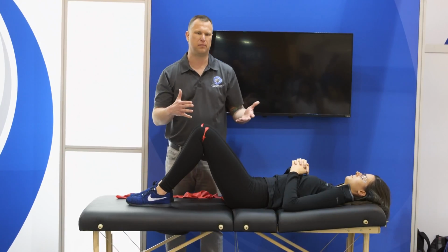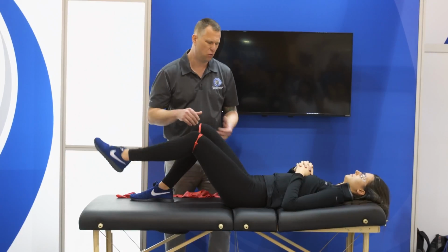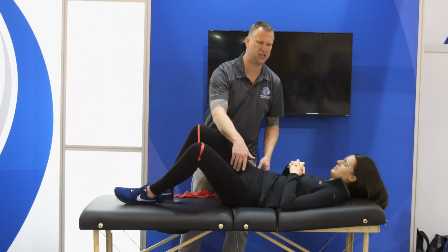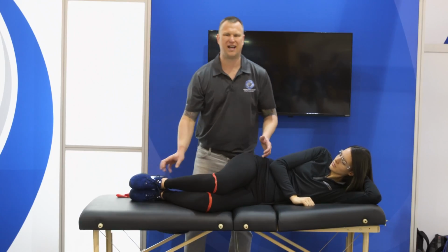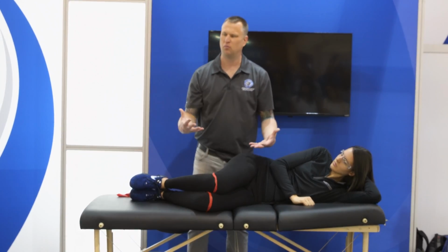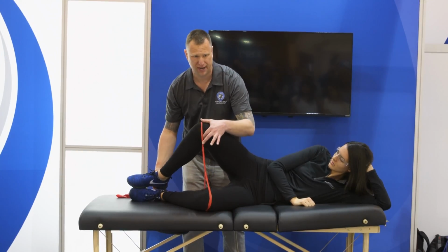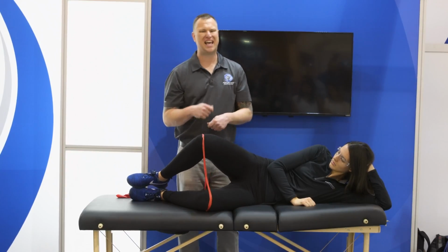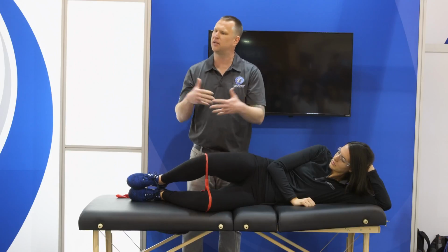Okay, so we're taking double leg bridging there. Could we progress to single leg bridges? Sure, we could do that. What if we went sideline? So we'll have our patient face away from me. And certainly we could progress into a standard, again, more or less a single plane exercise, kind of PT 101, into a clam exercise. But I want you to consider the value to the patient when you're not having to tell them, well, just tie the band around and create a loop and tie a knot because they may be untying or tying.